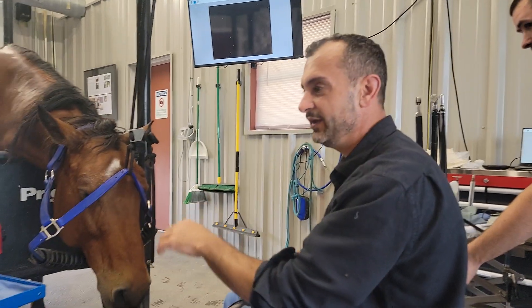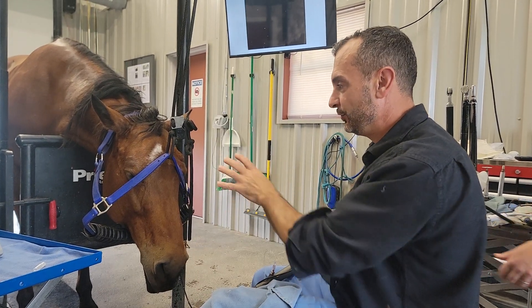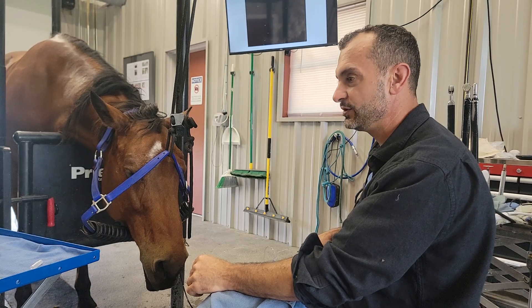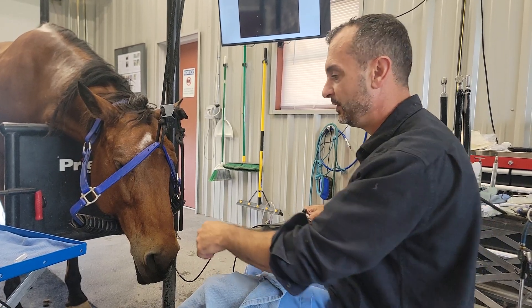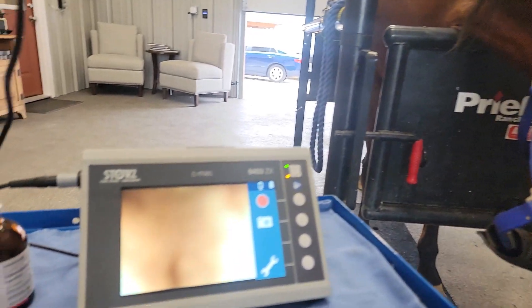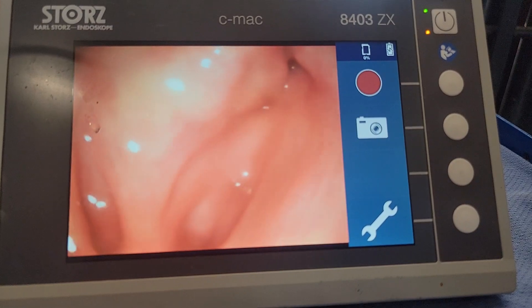Here we're doing what's called transnasal sinoscopy, where you don't always have to open up the sinuses to go into them. You can actually use a minimally invasive transnasal sinoscopy where we're using a small endoscope and going through the nose. This horse, you can see, has a chronic infection within the sinuses.